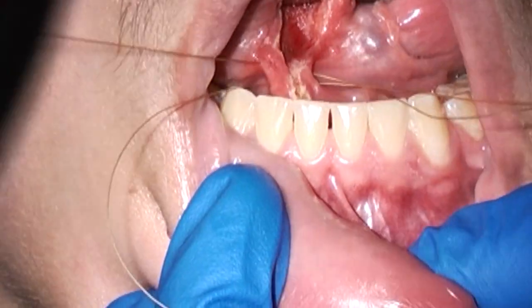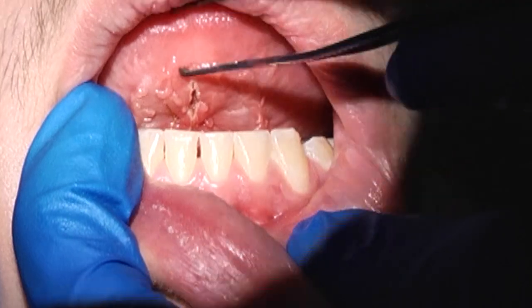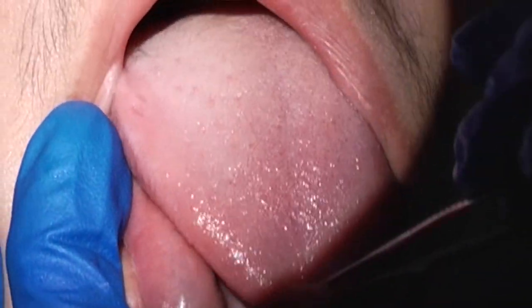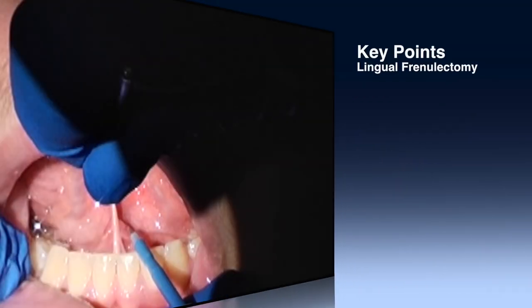Again, take care to avoid the submandibular duct papillae while you are suturing. Not every piece of the mucosa needs to be closed in any sort of watertight or airtight fashion, and we can see now the tongue protrudes easily beyond the teeth.